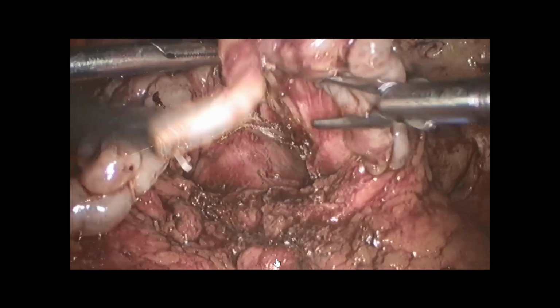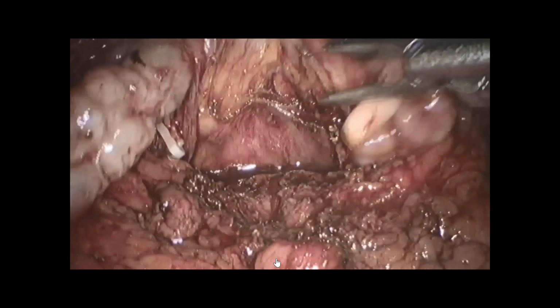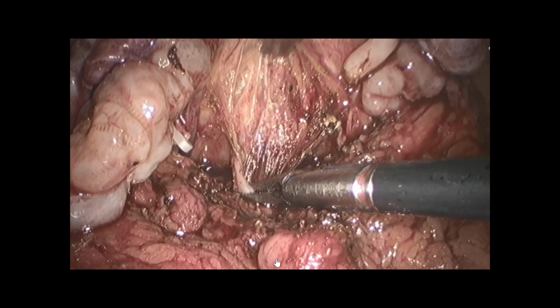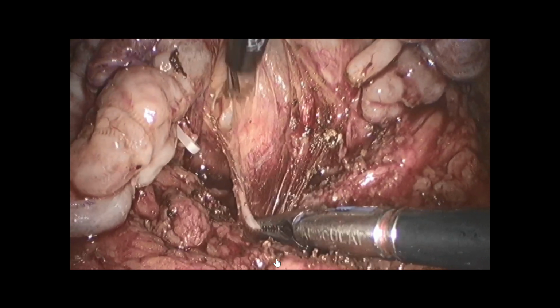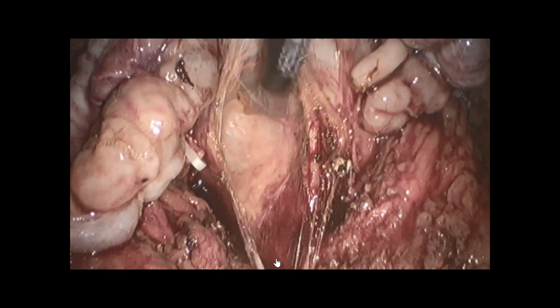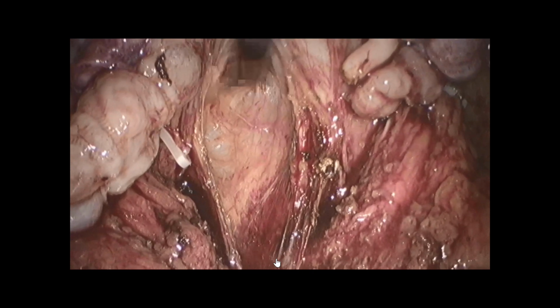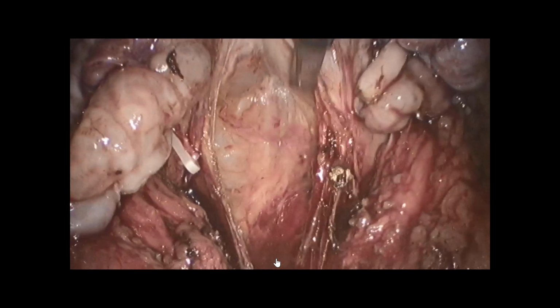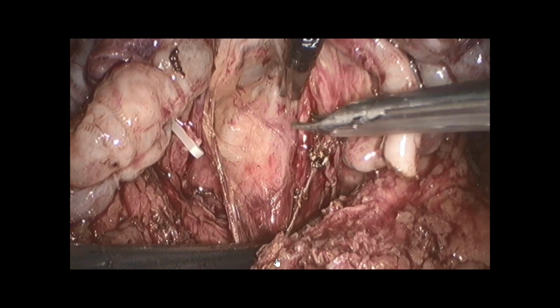It's very solid, and then I will just have to find now. You have to pay attention because the rectum is really close, and now I will go as high as possible to reach the prostate. You will see the prostate somewhere there. So the rectum is here, the prostate is here, you see the bulk of the prostate, okay? And now you really start the dissection.